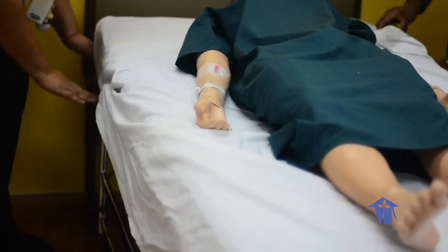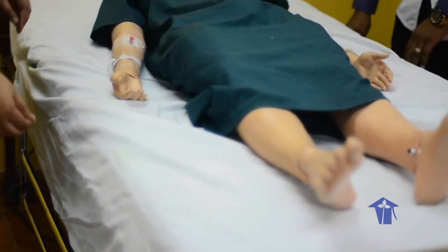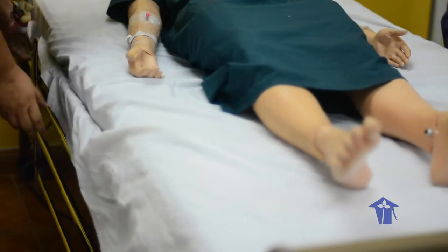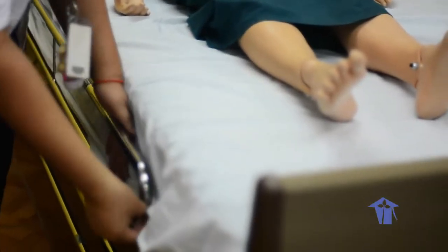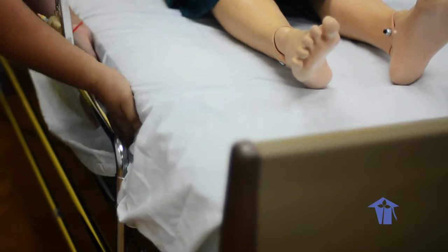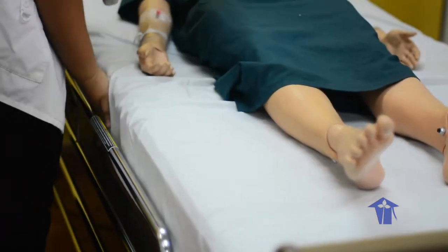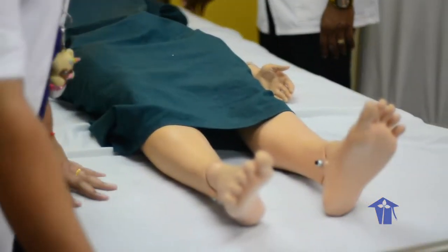Tuck it in. Don't forget your body mechanics. So we work together, okay? And then you tuck all the rest in. Obviously, because of this side rail, you'll get a little bit of difficulty. Good. Now we'll put our top sheet on.